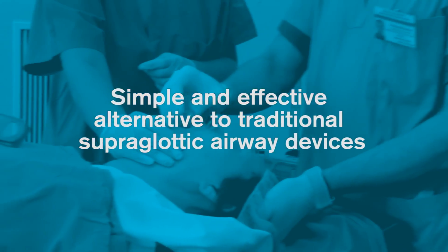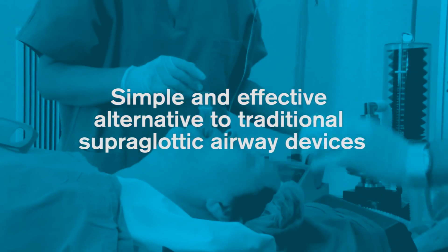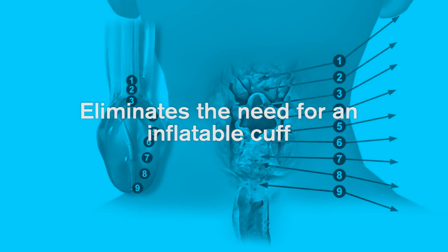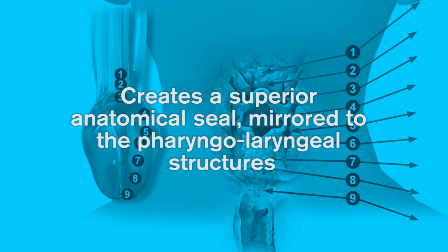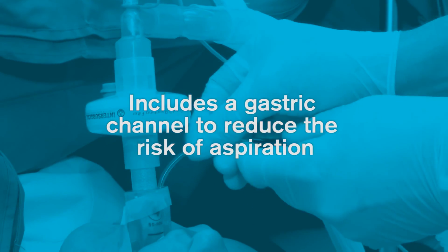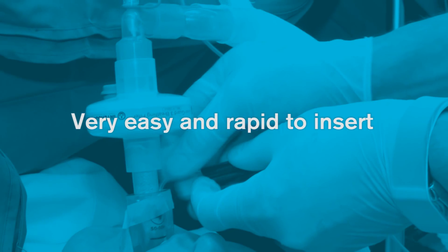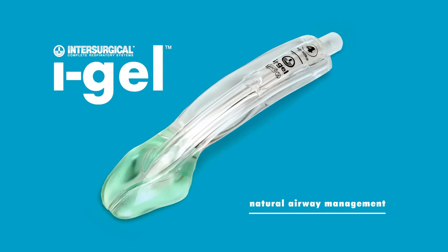In summary, iGel is a simple and effective alternative to traditional supraglottic airway devices. It has been designed to eliminate the need for an inflatable cuff and create a superior anatomical seal mirrored to the pharyngolaryngeal structures. It includes a gastric channel to reduce the risk of aspiration and is very easy and rapid to insert. iGel offers natural airway management.